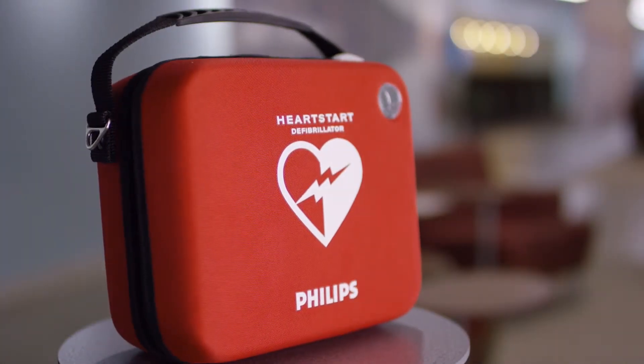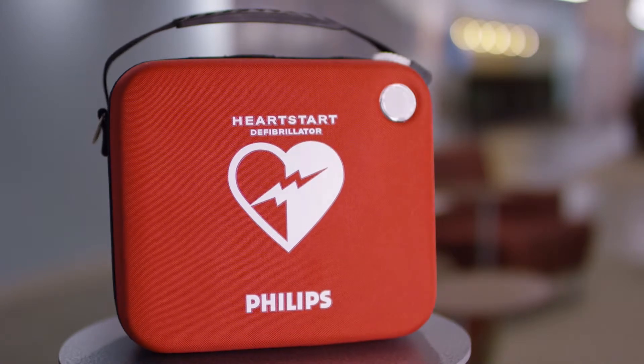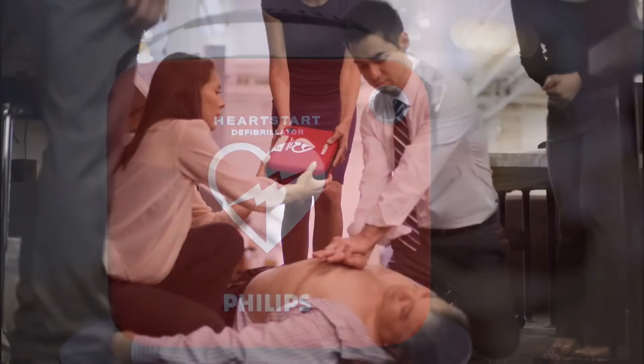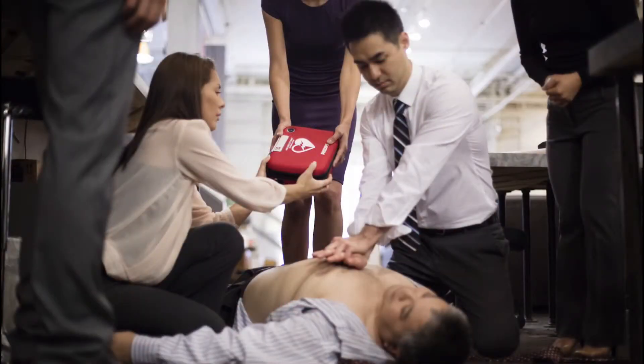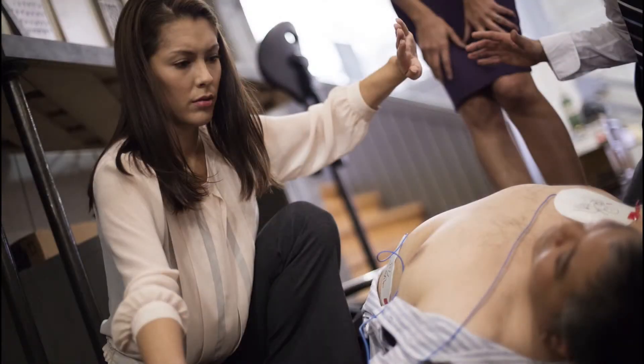AEDs can help people like you deliver therapy as quickly and safely as possible. While the idea of using one can be intimidating to an inexperienced or stressed responder, the good news is the Philips OnSite AED is actually really easy to use.